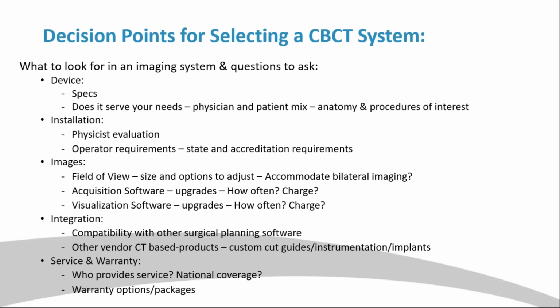So same kind of thing about what do you want to do with these scans? Is there compatibility with other surgical software? There are some specialists that are very familiar with certain planning software, and you want to make sure that they're able to be integrated. The other thing you want to look at is, are there other vendors that have CT-based products that are really important to your practice? So like we've discussed, custom cut guides, instrumentation, implants.